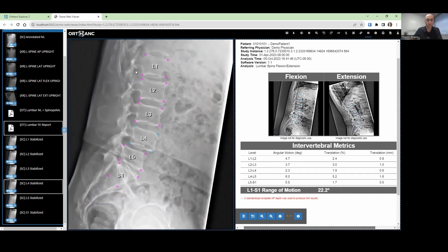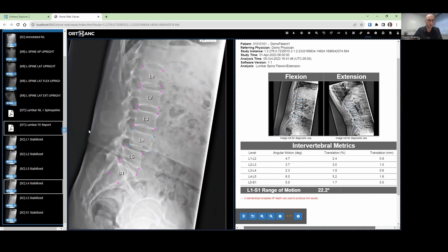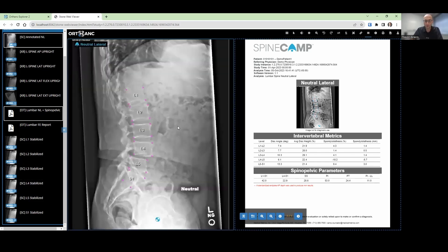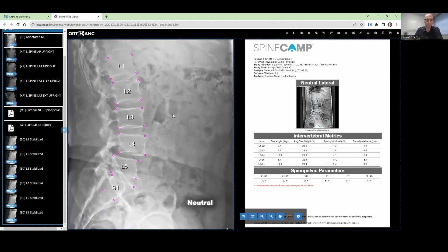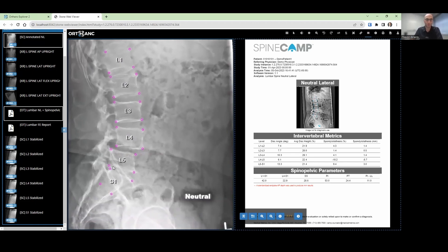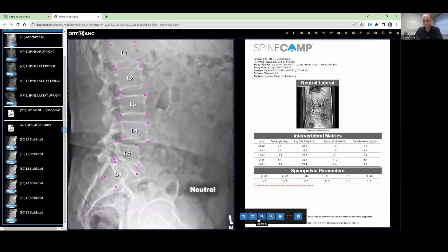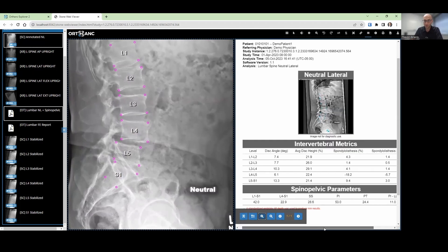Aside from the flexion extension analysis, SpineCamp will also analyze neutral lateral imaging and provide you with a report on the segmental alignment, including disc angle, disc height, and spondylolisthesis. We can provide spinal pelvic parameters. You can see that we annotate the neutral lateral image just like we annotate the flexion extension image — all vertebral bodies are labeled, the corners are specified, the femoral heads are identified, and we actually specify the midpoint between the femoral head centers with a crosshatch landmark. All that information is used in the calculations reported here for your visibility.